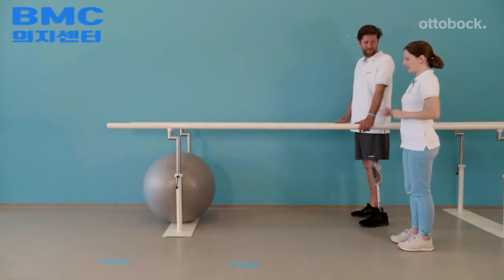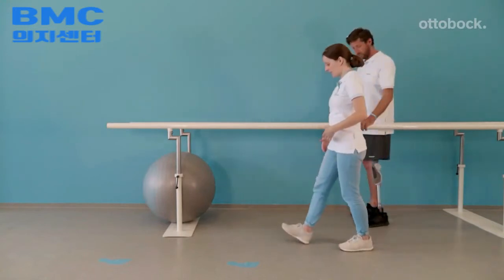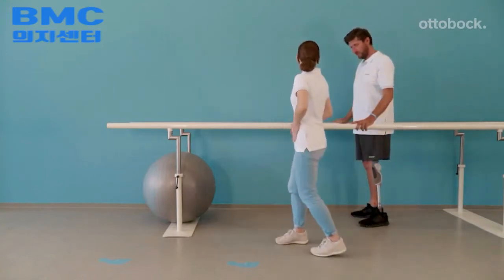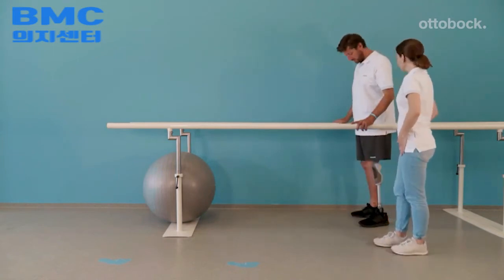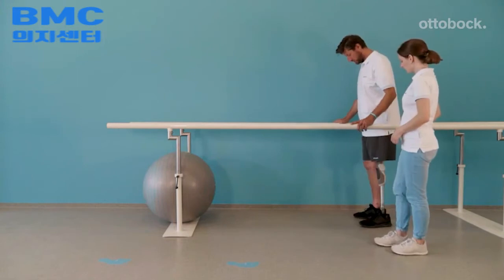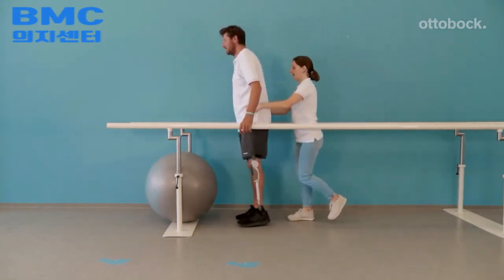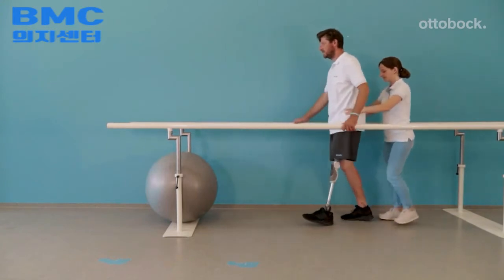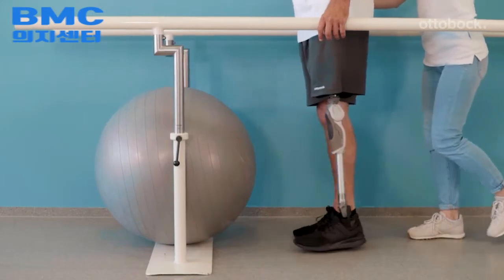For initiating stance release, two requirements are needed: first, a good foot rollover behavior which leads to a knee joint extension moment, and second, hip flexion initiation without hesitation. Kicking a gymnastic ball can help to activate the hip flexors. The model shows how to kick the gymnastic ball with as little power as possible.